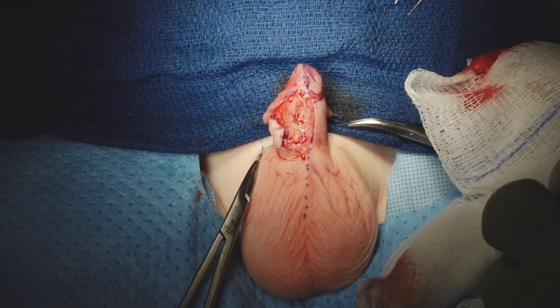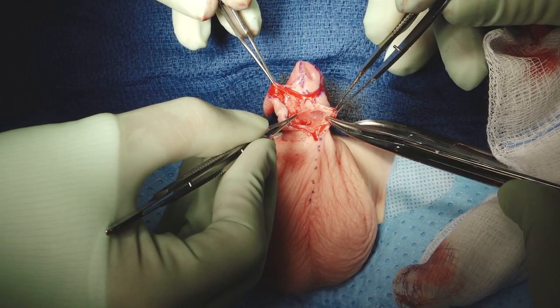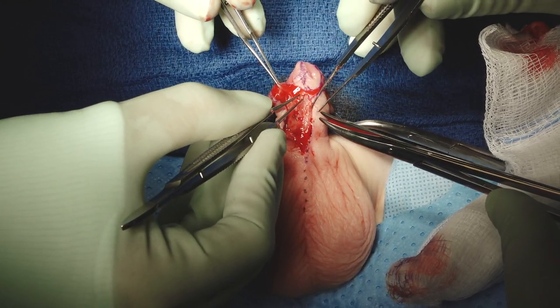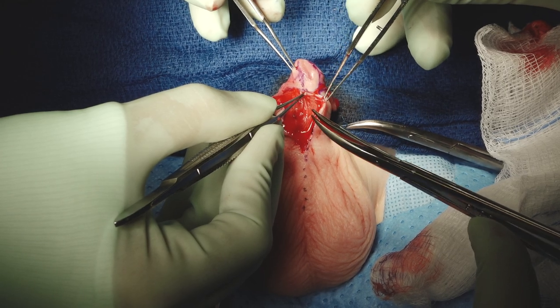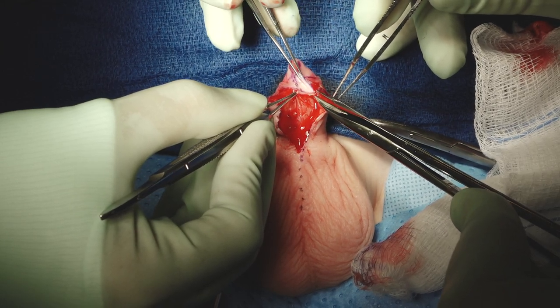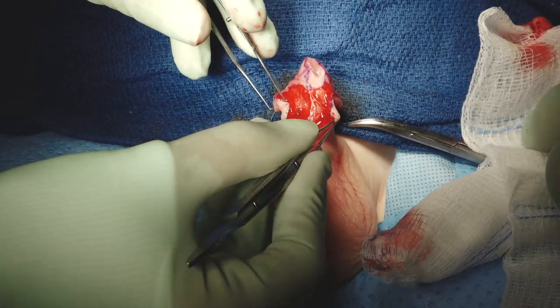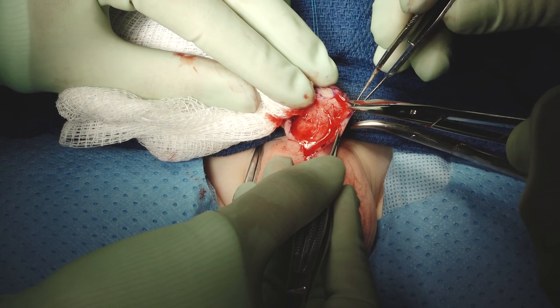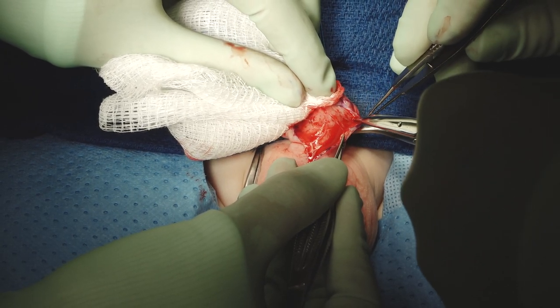We'll make our way to the other side. In some ways, instead of holding the penis the way I used to in old videos, this way we're both seeing it clearly — it's just a different way to dissect to get the operation started. The people who trained with me have heard me say many times that the presence of a penis isn't the reason to do a degloving — not every penis needs to be fully degloved. We anticipate we will be doing that in him, but we don't have to start out with it.